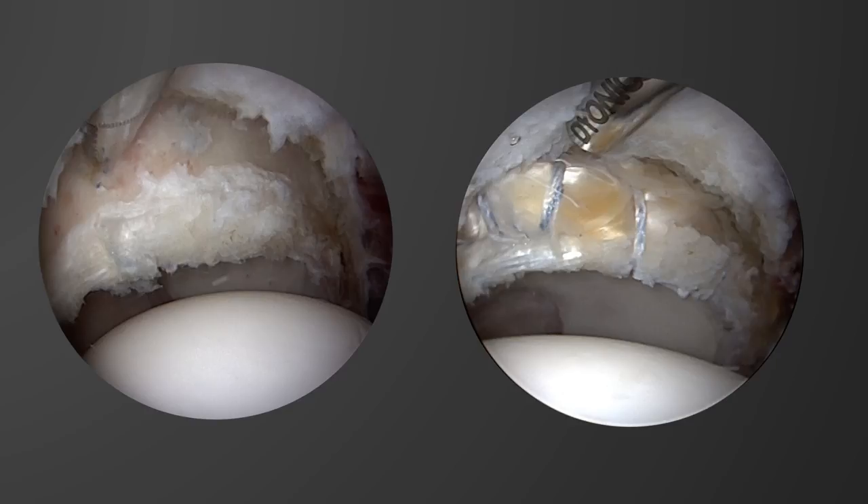Here is a case example. On the left is a bird's-eye, extra-articular view showing the capsular side of the labrum and the acetabular rim. This is a revision case — you can see evidence of prior anchors in the rim. The labrum was not in good condition, with only about two or three millimeters of width remaining — not enough to achieve a good seal, but enough that it may be worth preserving. On the right, you can see where we have incorporated the graft and the native labrum into the same sutures, rolling them together so they become one, achieving a much better seal than the native labrum alone could provide.